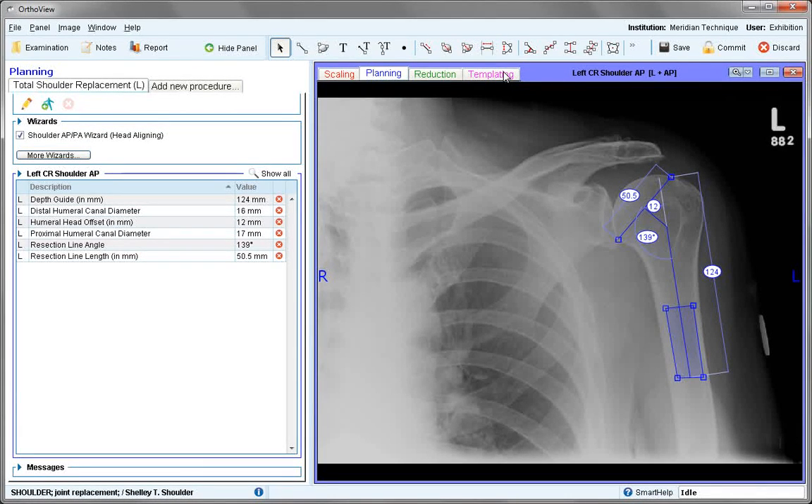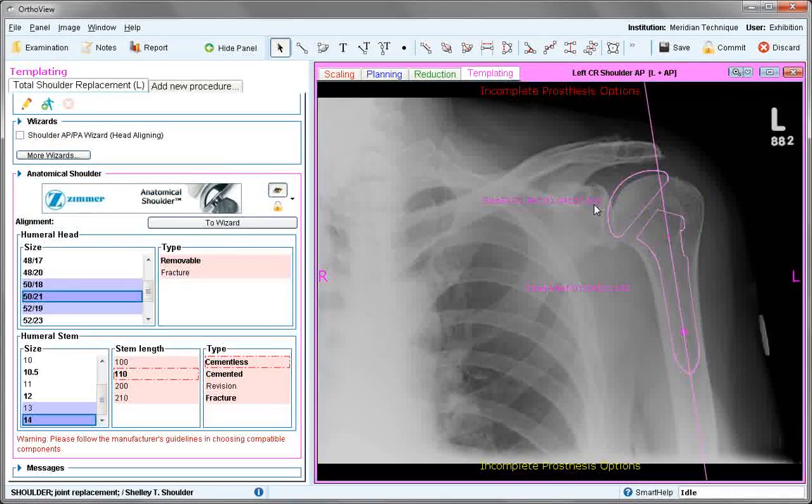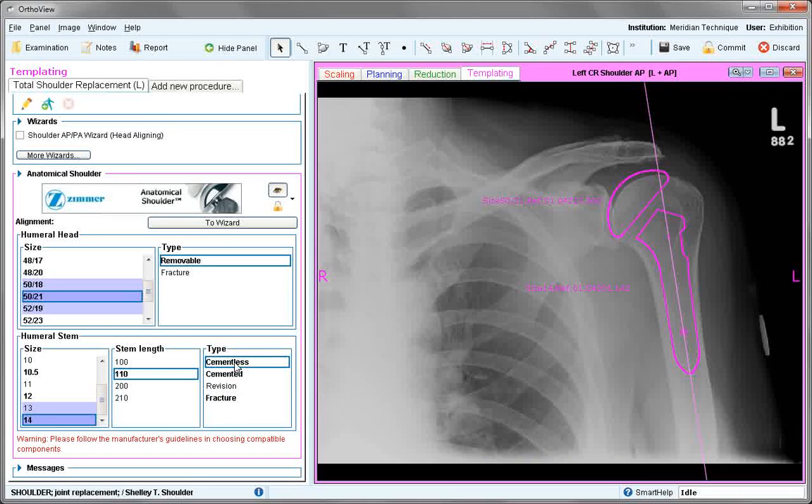When happy with the position, move to templating. The template will be positioned for you. Some parameters in red still need to be selected and compatibility of different factors needs to be considered — for example, certain sizes cannot be combined. Test different sizes to see which is the best fit and adjust the stem if required.